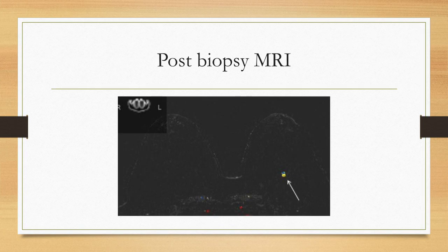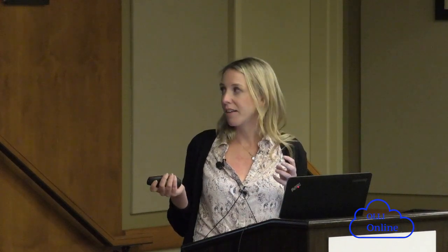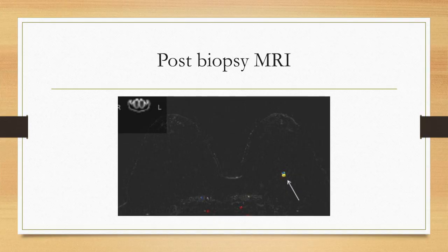Now, at St. Jude, this is how the breast surgeons operate: most patients that have a diagnosis of breast cancer will get an MRI. What that does is it helps us look at the other breast and also make sure we're not missing any additional disease in the same breast, so that when they go to surgery, they know exactly what extent of tissue they need to remove, or if a patient's a better candidate for mastectomy. So this patient was exactly what you want to see. Small mass on a screening mammogram, and she got the breast MRI and no other enhancement. So this is the right breast. You don't see anything light up. Here's the left breast, and there's that tiny cancer.